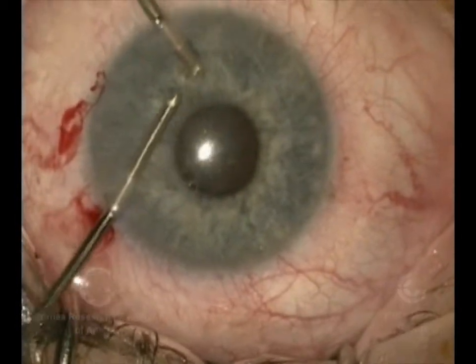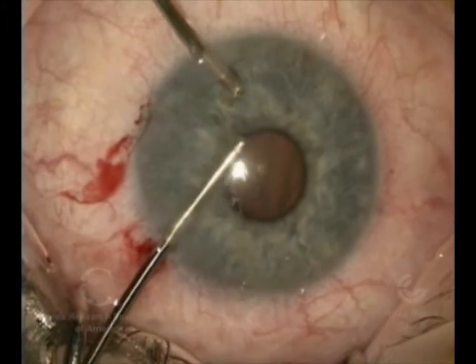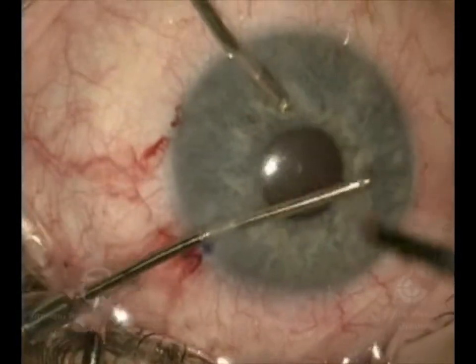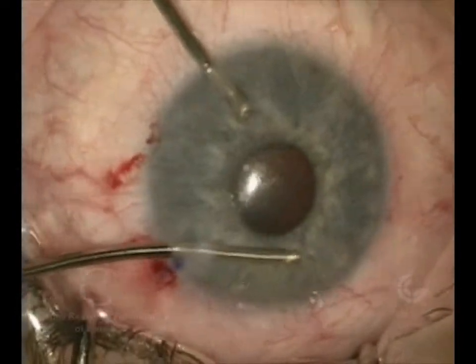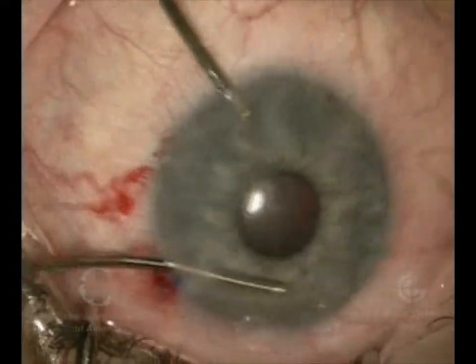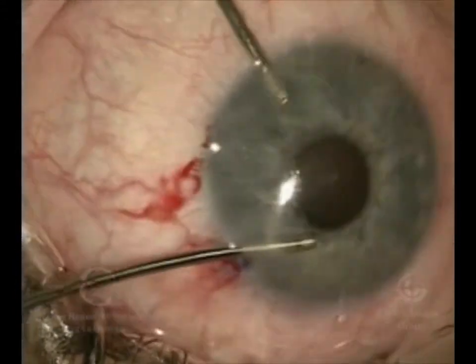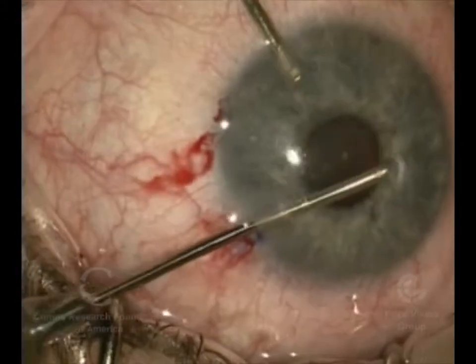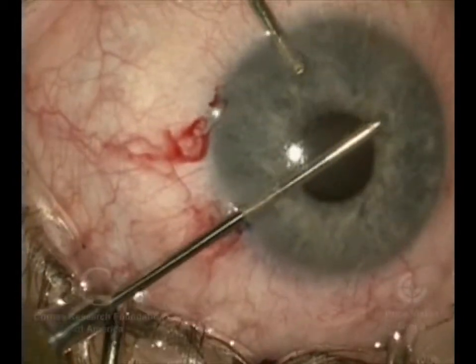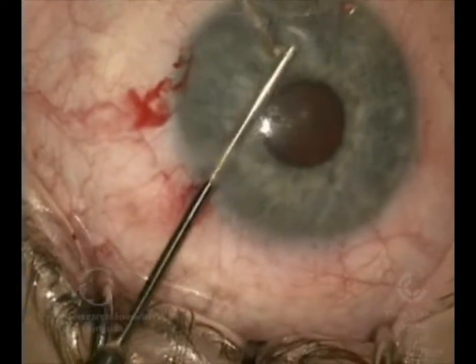These devices are both placing fluid into the eye and at the same time out of the other handpiece we're aspirating out the viscoelastic. We want to make sure we vacuum all the viscoelastic off the back of the cornea. In fact, we'll provide a reference at the end that we've published demonstrating how if you don't remove this, you can get difficulties with interface haze and scarring between the donor and the recipient cornea.